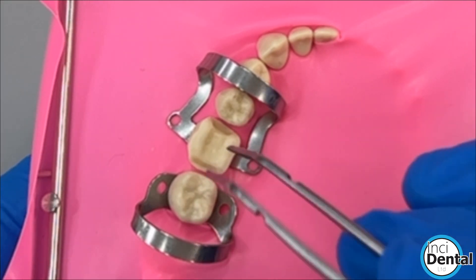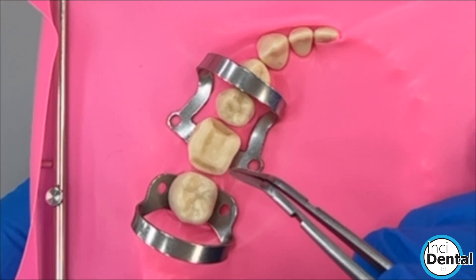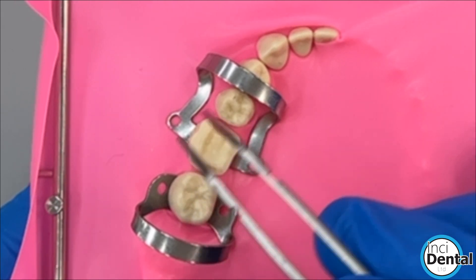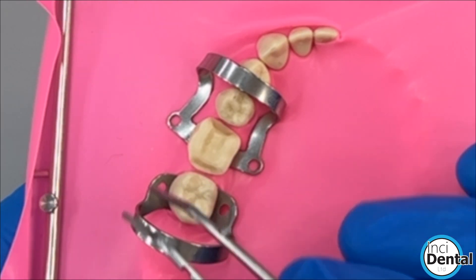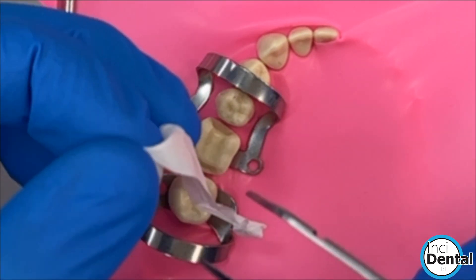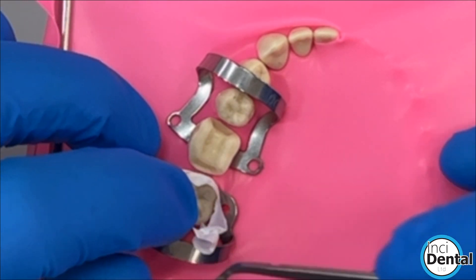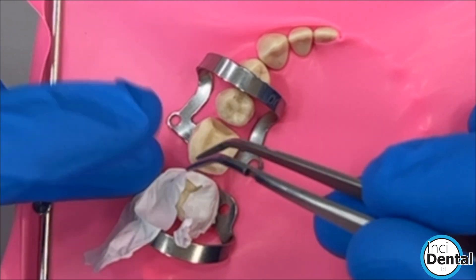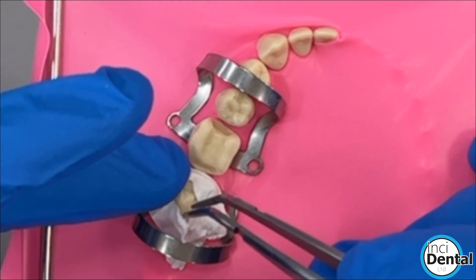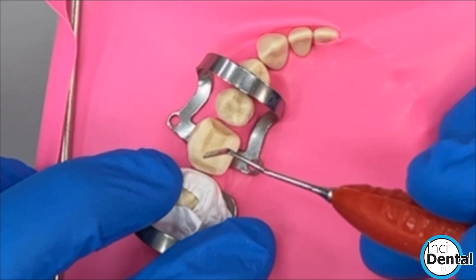I like to isolate the tooth with a metal band and sandblast the immediate dentin seal ready for bonding. I will etch the whole surface and rinse it off. After that, I like to do an extra step which is to isolate with some PTFE tape. I do it after etching, just because sometimes it will move when you rinse all the etch off, but this way it'll stop the bond from reaching the adjacent tooth.